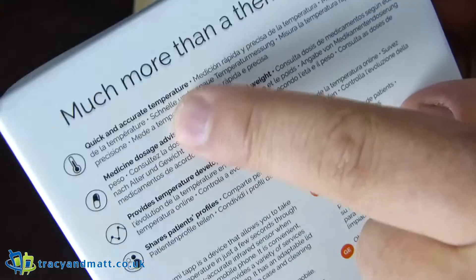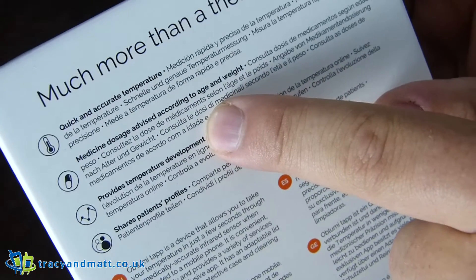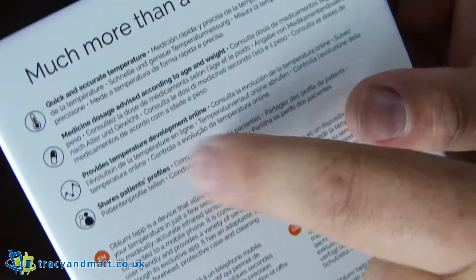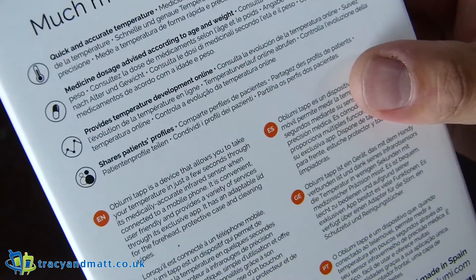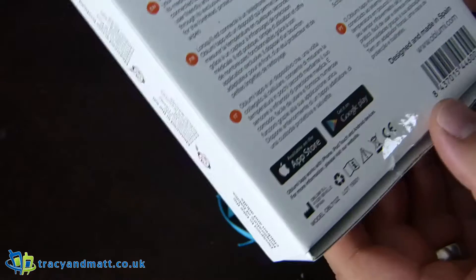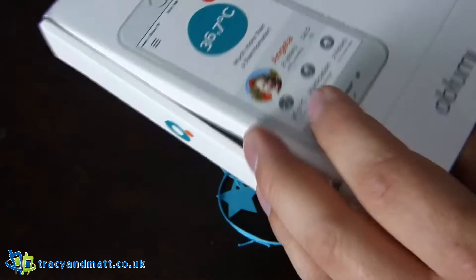What does it say here? Quick and accurate temperature. Medical dosage advised according to age and weight. Provides temperature development online and shares patient's profile. So I guess you could send it to your doctor or share it with Facebook to prove that your child is sick. Who knows?